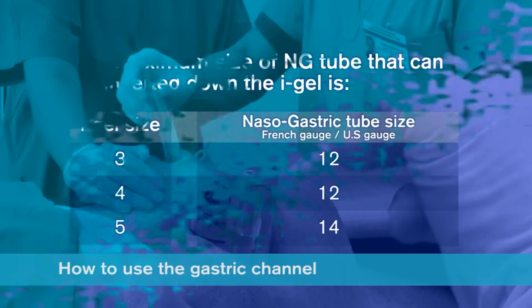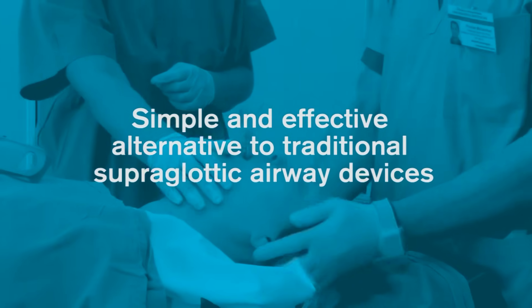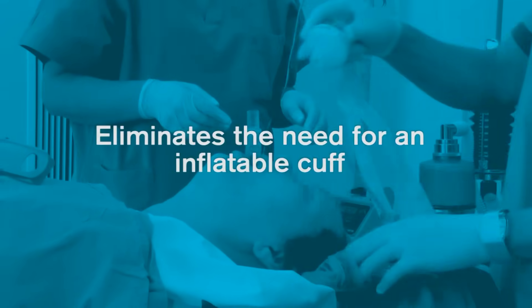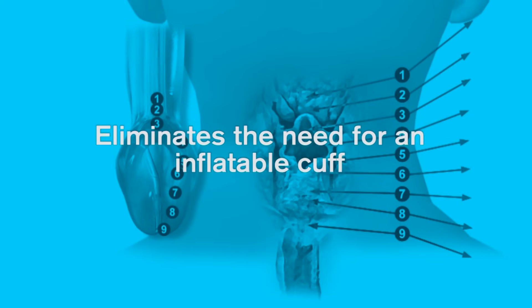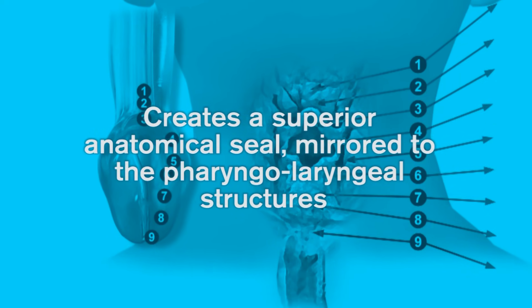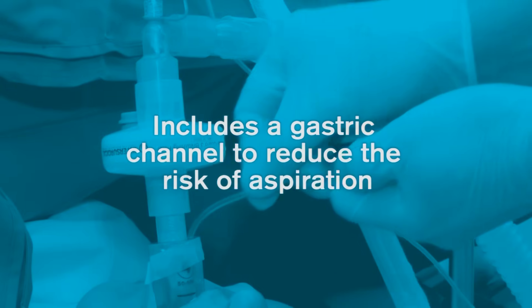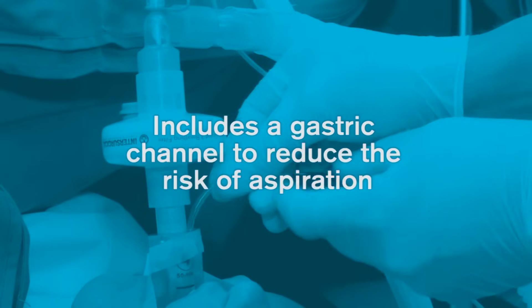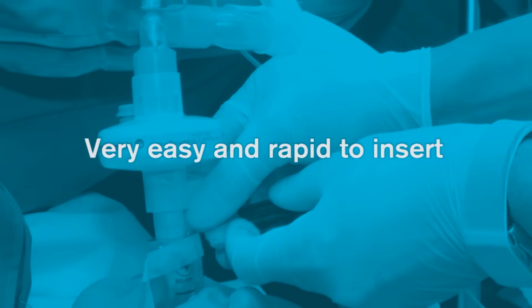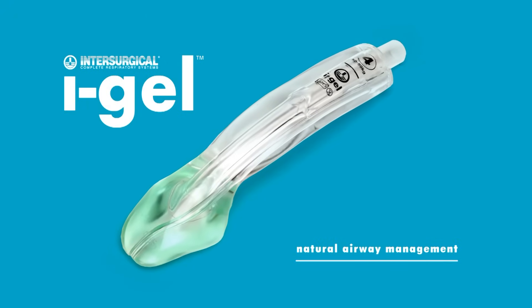In summary, iGel is a simple and effective alternative to traditional supraglottic airway devices. iGel has been designed to eliminate the need for an inflatable cuff and create a superior anatomical seal mirrored to the pharyngolaryngeal structures. It includes a gastric channel to reduce the risk of aspiration and is very easy and rapid to insert. iGel offers natural airway management.